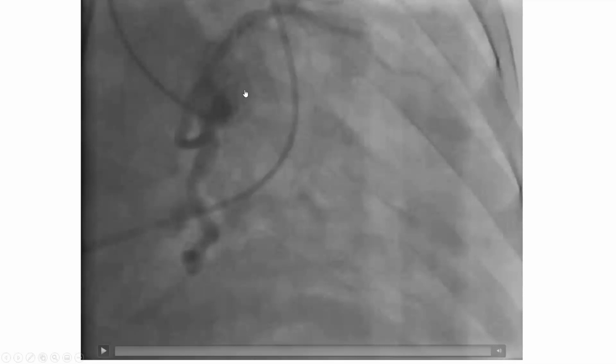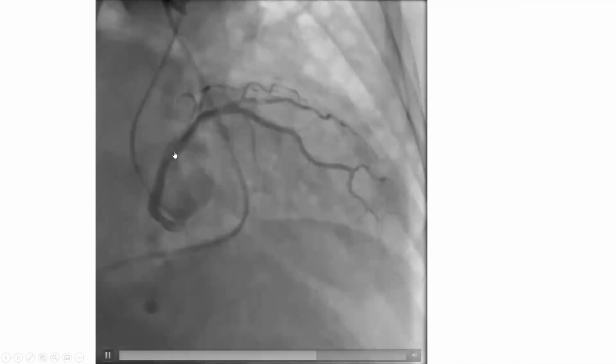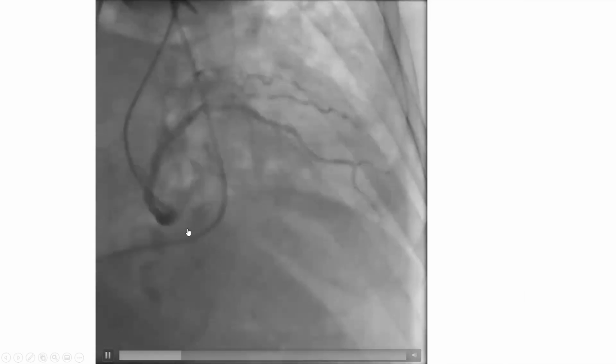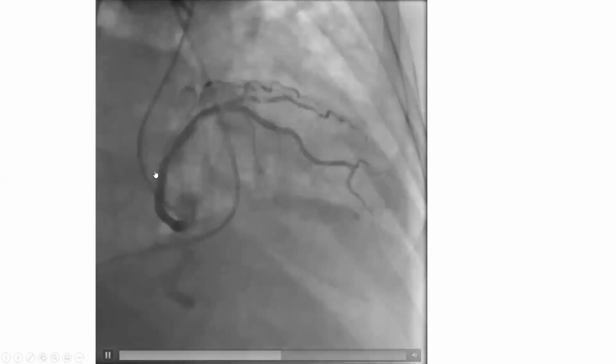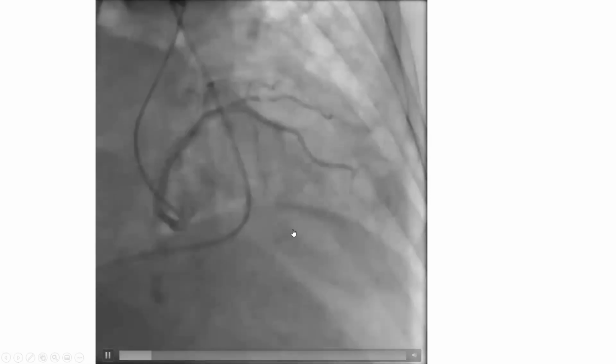If you have an anterior or pre-pulmonic course, generally it's not just anterior, it's upward looking, and you need something like an Amplatz left to engage it, okay? And this is what was done here. Here we used Amplatz left to engage this downward looking coronary. If you're good with the Amplatz left, you can make it point down. In an elongated way, it looks down. In a duck-shaped, properly shaped way, it will look up.